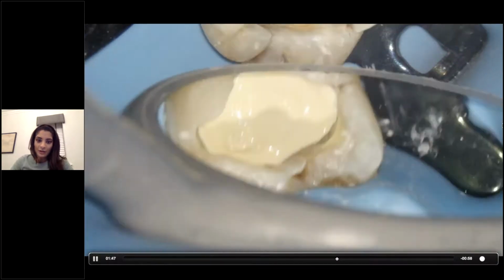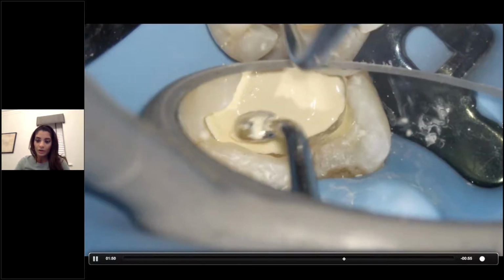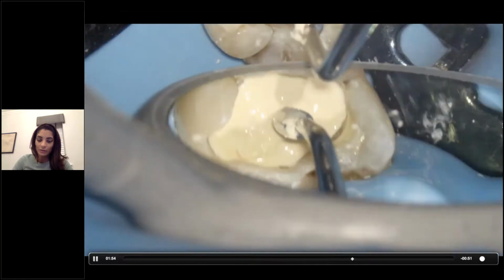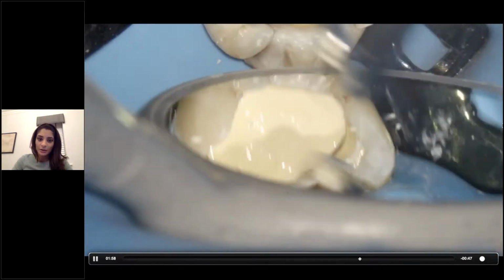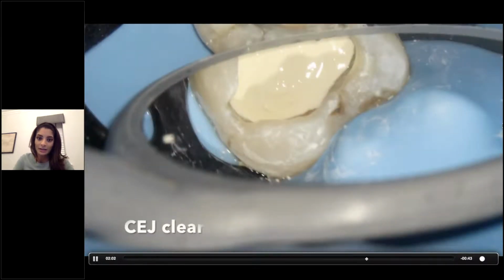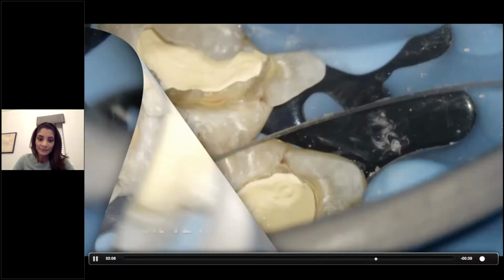The main thing that I'm trying to do here is not get the biodentine on the peripheral walls, because I want a good bond with my composite there. And it's a little bit of a pain to remove it once it's splattered all over the walls. So if you can use it in a very controlled technique, it's so much better. You can see as I tilt my mirror, the CEJ's completely clear.